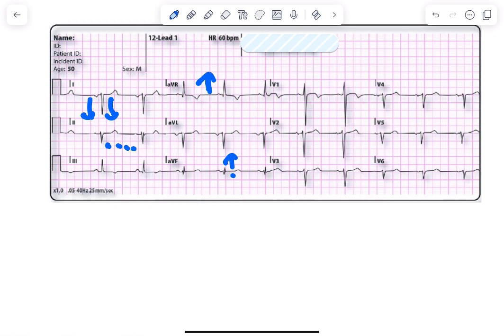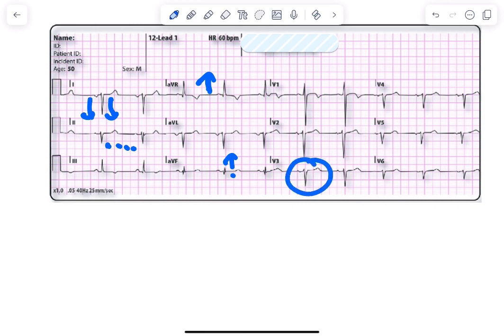Let's look at what happened to our R wave progression. Lead V3 shows poor R wave progression, so there is no R wave which is crossing more than 3 mm. So it is poor R wave progression.